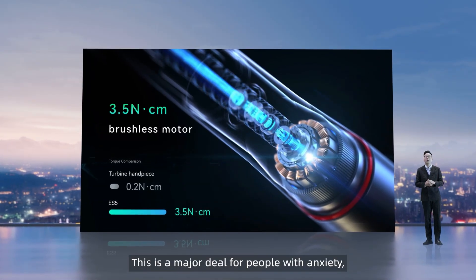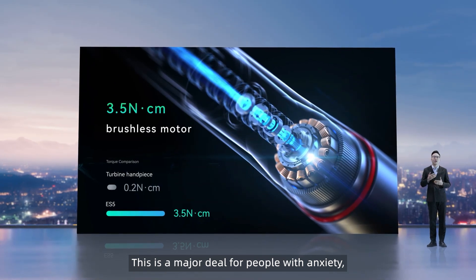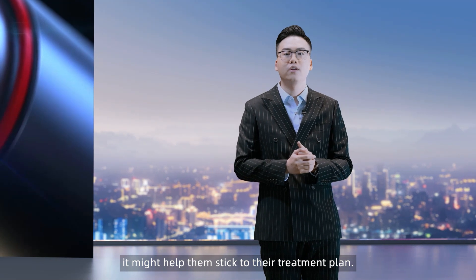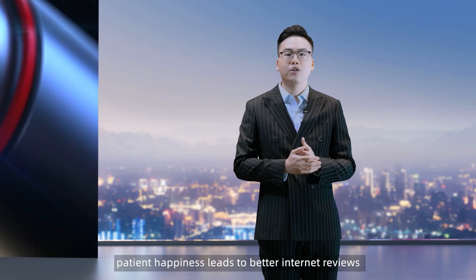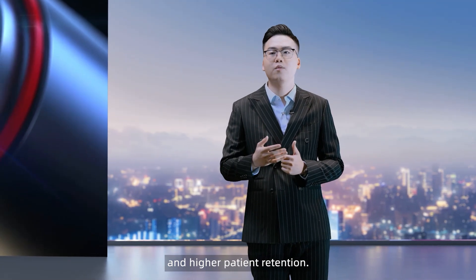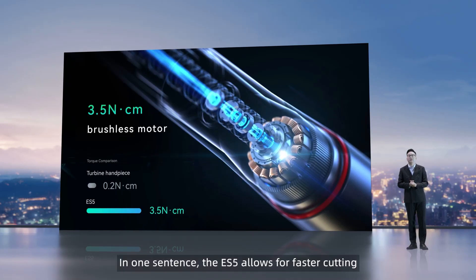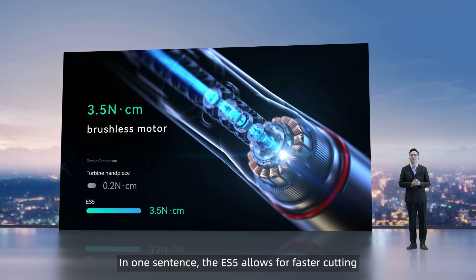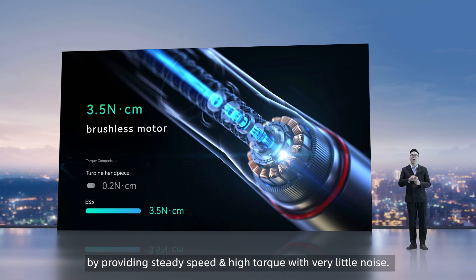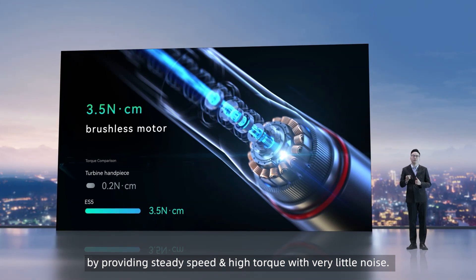This is a major deal for people with anxiety, as it might help them stick to their treatment plan. Furthermore, patient happiness leads to better internet reviews and higher patient retention. In one sentence: the ES5 allows for faster cutting and maximum handpiece durability by providing steady speed and high torque with very little noise.